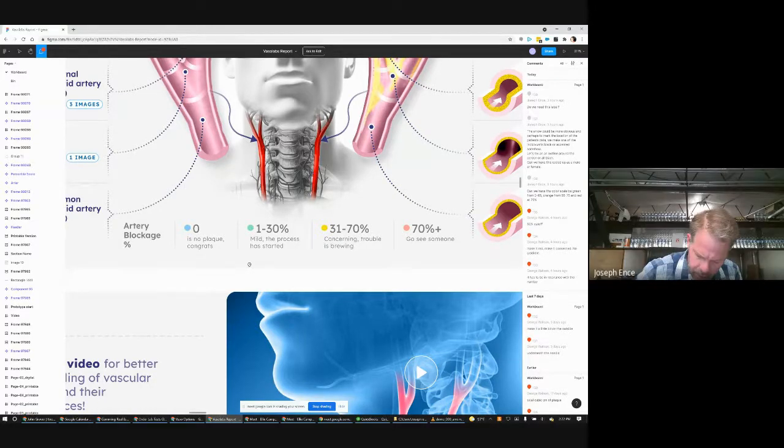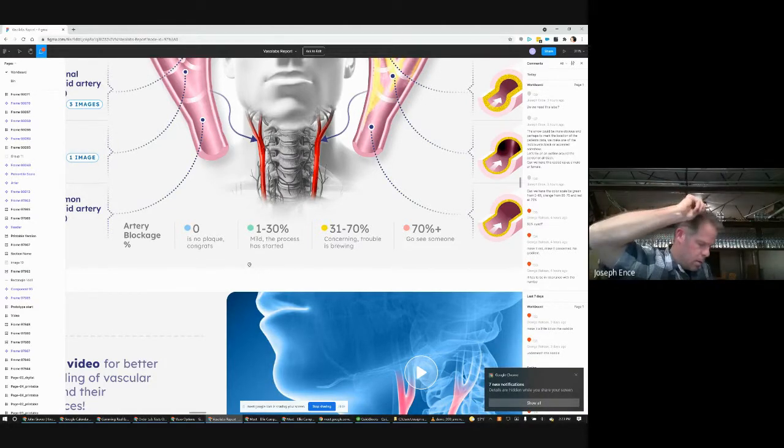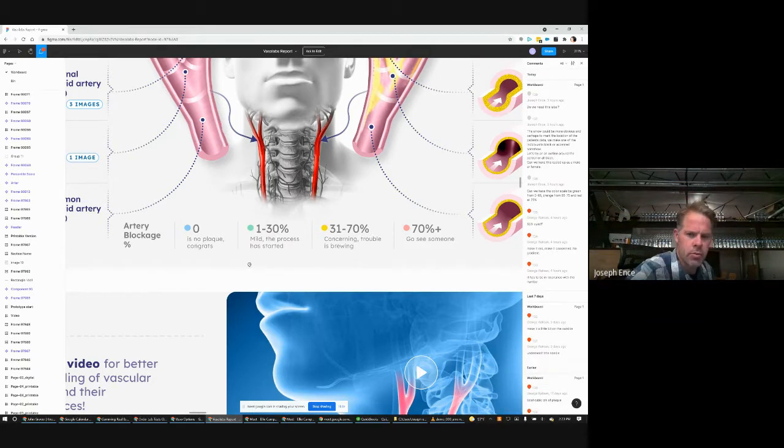How often have you seen an IMT where you didn't trust it, or you were like, you know what, these blood markers are horrible? What did you think and how did you interpret that? I always tell people this is one data point in time, and we need to get more data points before we're sure. So we're going to do this again in a year, or maybe even six months if I had a high suspicion. If they were obese, hypertensive, diabetic, a smoker, and had nothing, I would probably check them again in six months. Okay, the data point. How often does that happen where you're distrustful?